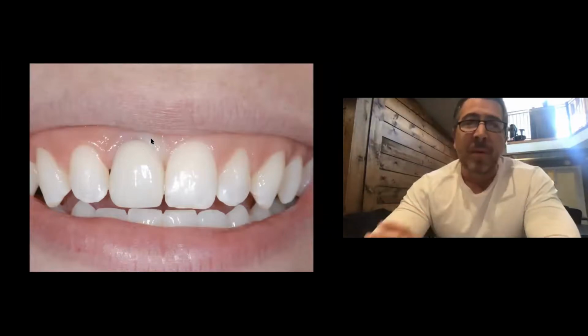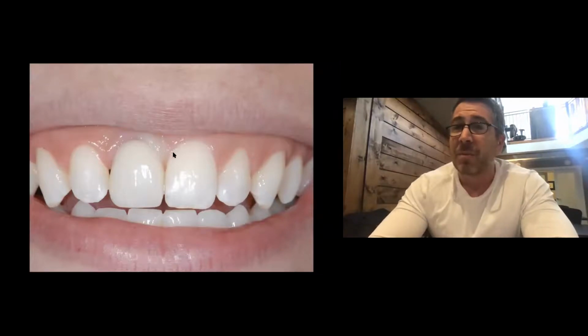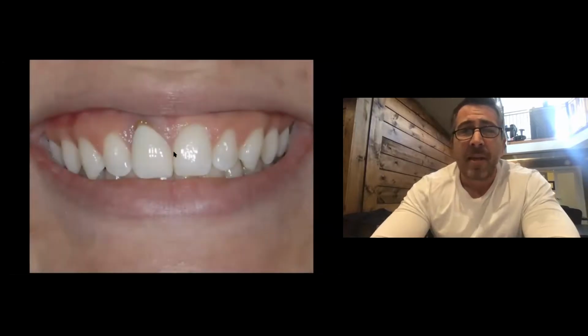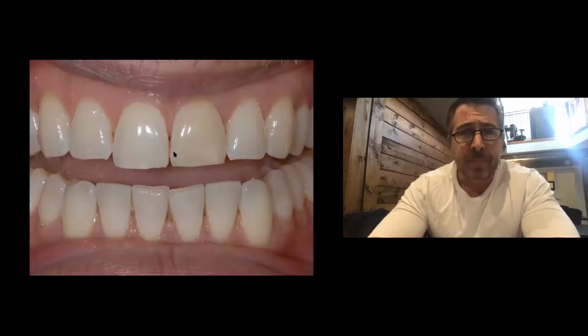So you got surgical people that need to create the tissue for you, and then you got restorative people that need to shape the tissue appropriately. So interdental height of bone is going to get my papillas, but the zenith is going to be dictated by the crest of the bone and the shape of the crown. That's what we started with, and that's how we ended up. I think pretty decent result.